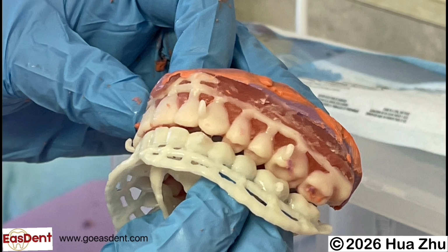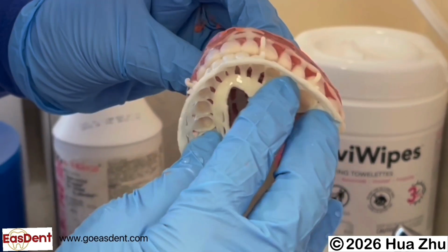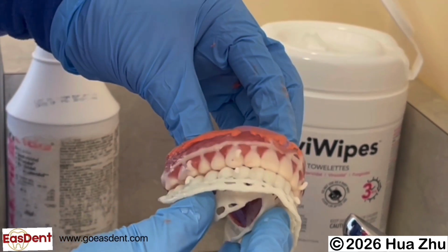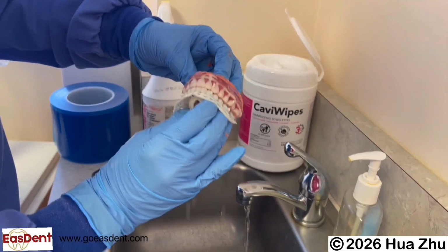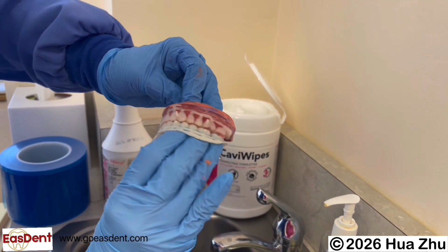Check if maxillary Easdent teeth can still occlude nicely with mandibular Easdent teeth in your hand first. If the occlusion of the maxillary teeth has changed a little bit and the maxillary and mandibular teeth cannot get perfect occlusion, warm the mandibular Easdent tray in the hot water, then push the mandibular tray against the maxillary Easdent impression to let the teeth occlude nicely together. To make it harden faster, you can let cold water cool it down. Now you have maxillary and mandibular Easdent teeth that occlude nicely.